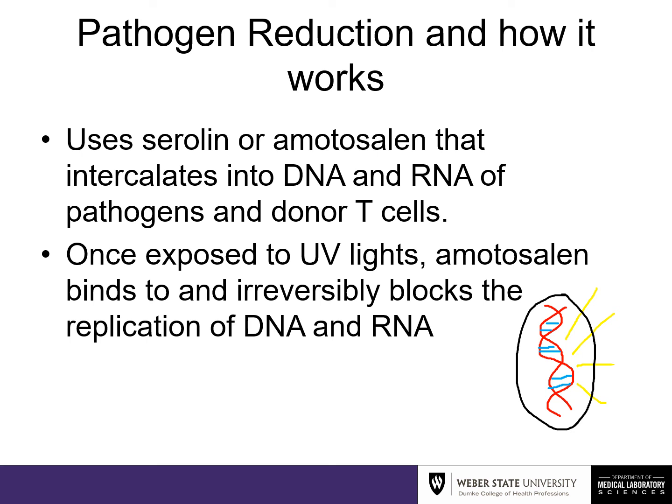Since the UV light has come onto the amotosalen, it binds and it won't break. Therefore, the DNA won't unravel to be able to duplicate or replicate for that disease or the bacteria and everything. Which is pretty cool, I think.